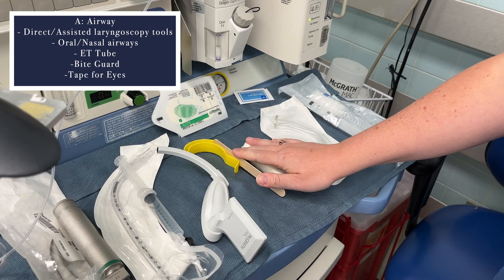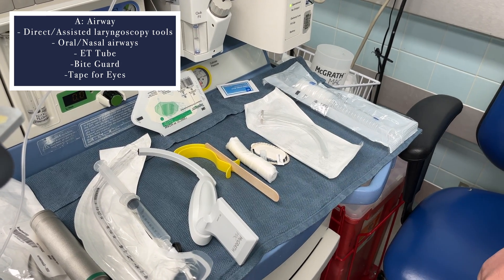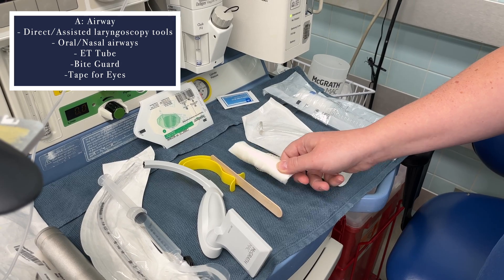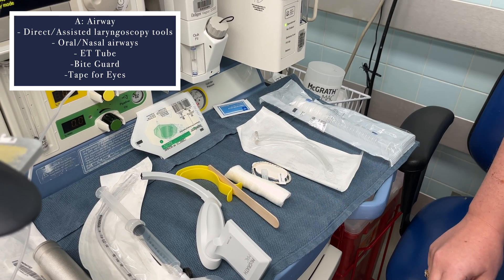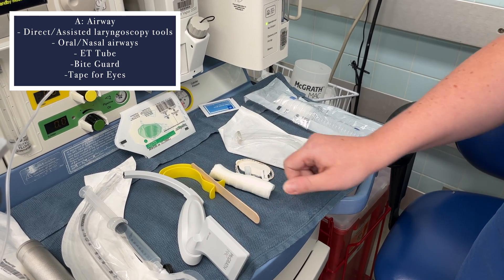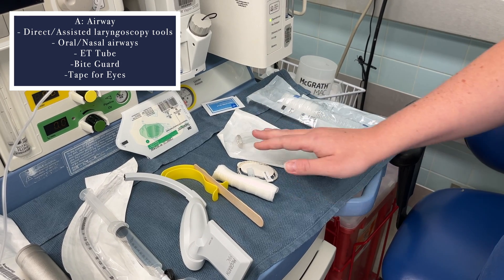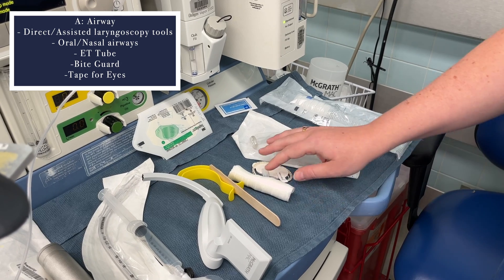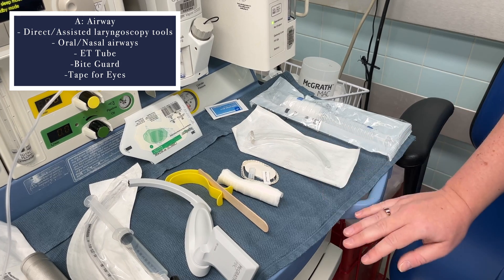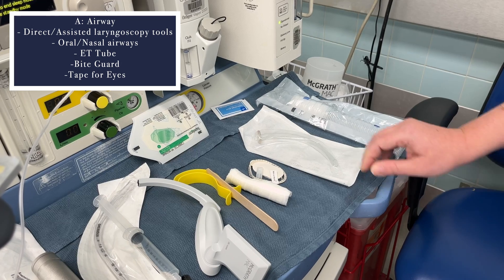Next we have an oral airway with a tongue depressor, which can help with bag mask ventilation. We also have a bite block — which we make here by hand — to prevent the patient from biting down on the tube and stopping ventilation; it can be placed right after intubation or just before extubation. A nasal trumpet is another airway device you can use to prevent obstruction, so having that on standby is good.